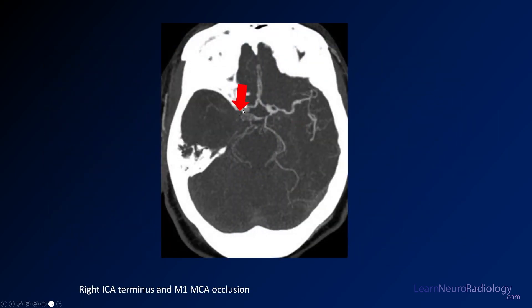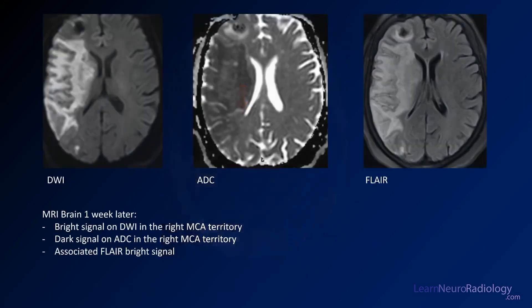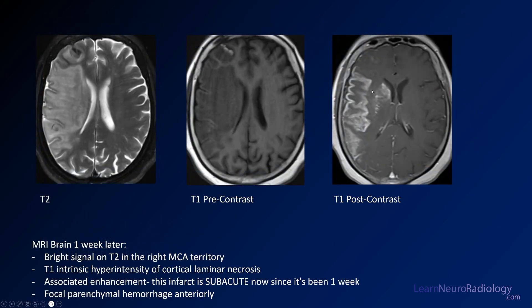On the CTA, you see truncation of the MCA with really no MCA seen on the MIP — confirming occlusion of the right carotid terminus and MCA. The MRI confirms the CT findings: bright diffusion in the MCA distribution, dark on ADC, and bright on FLAIR — very characteristic of an MCA infarct. On post-contrast, gyroform enhancement and enhancement of the caudate and basal ganglia indicate a somewhat older infarct. There's also probably a little hemorrhage in the frontal lobe adjacent to the infarct.